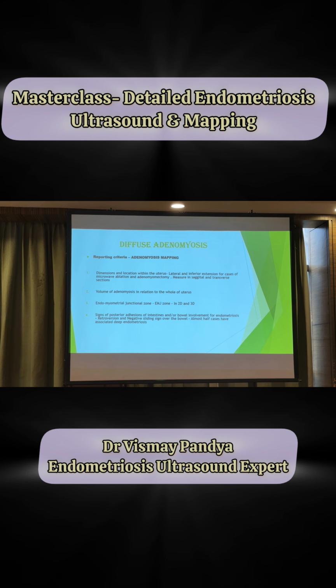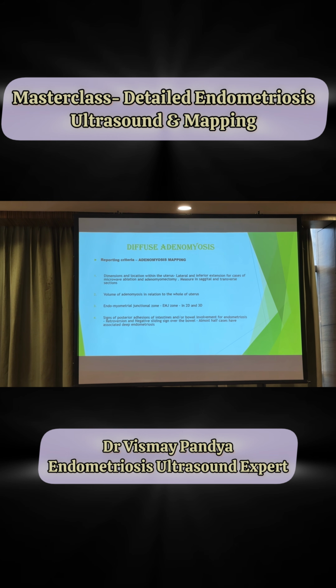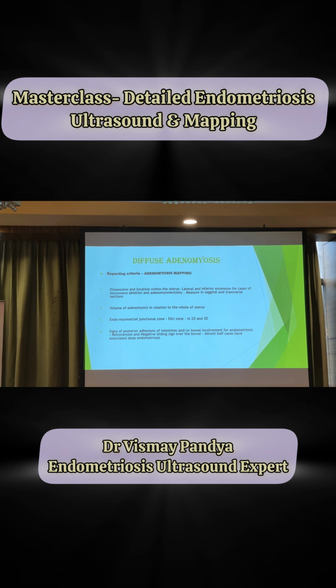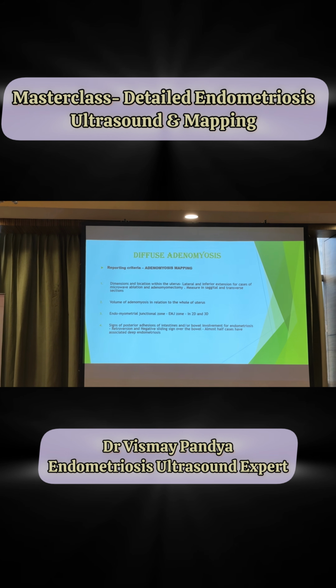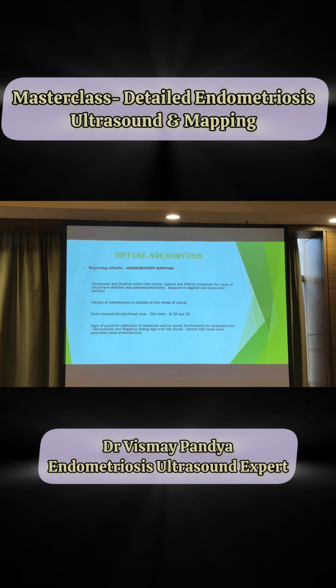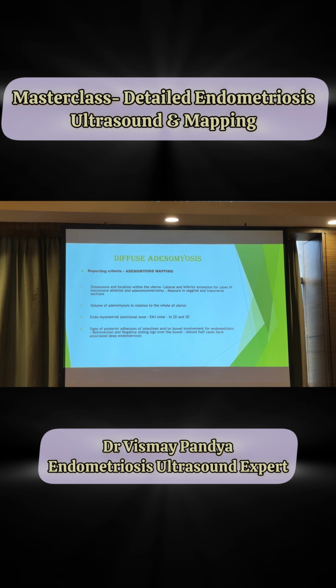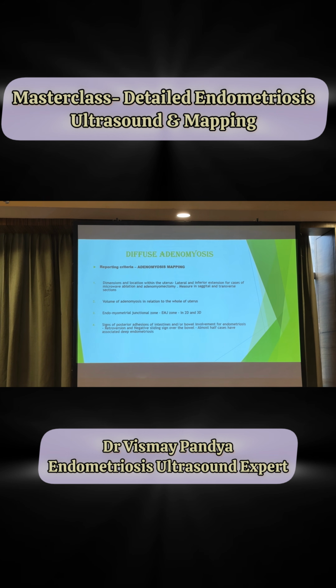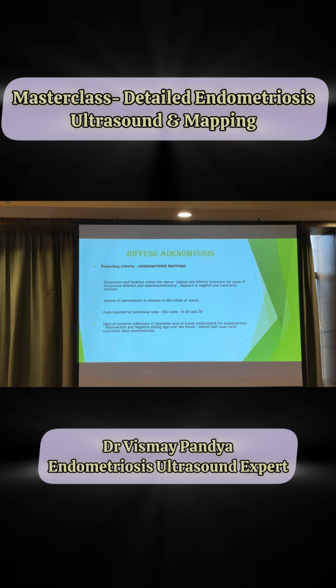In the diffuse criteria, we do something called adenomyosis mapping. Now, what is it? First, we locate the dimension and the location within the uterus. You have to report the lateral and the inferior extension for cases where we have to do microwave ablation and also adenomyomectomy. So we do it in two sections.